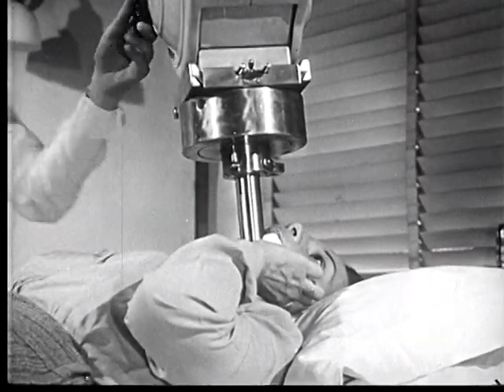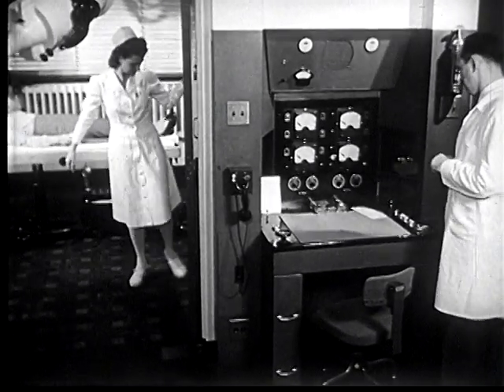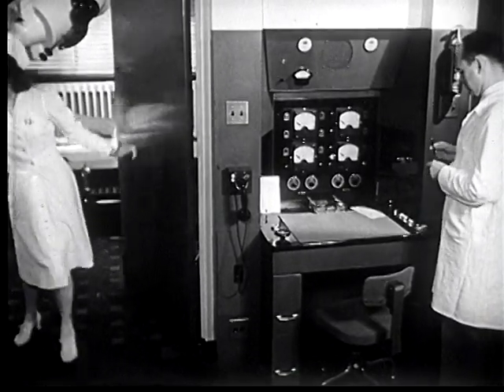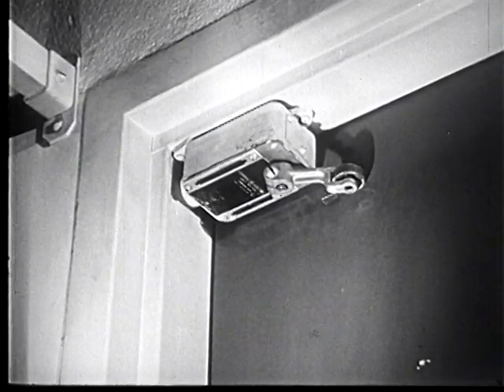Before the technician leaves, she makes a quick visual check of the treatment room. Not until the lead-lined door is shut can the X-ray be turned on, for a safety switch is there to prevent accidental exposure to X-rays.